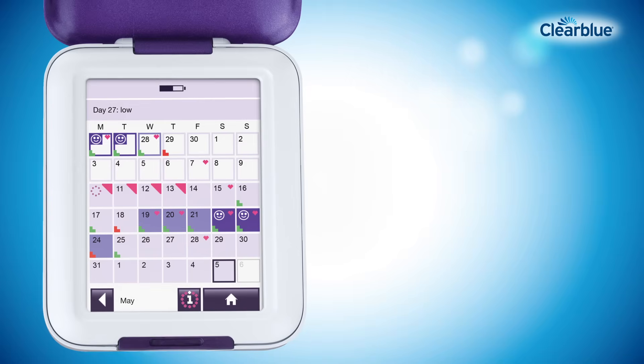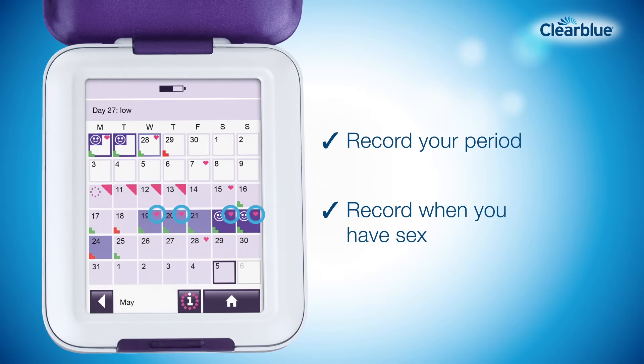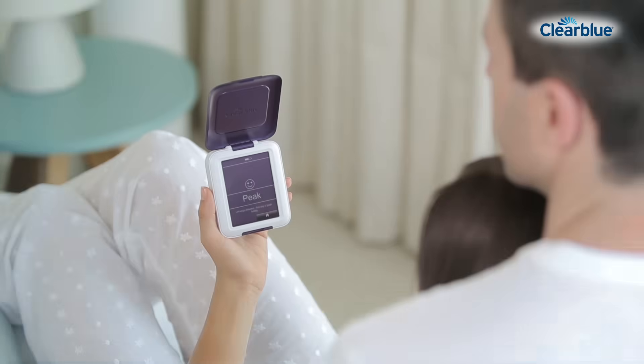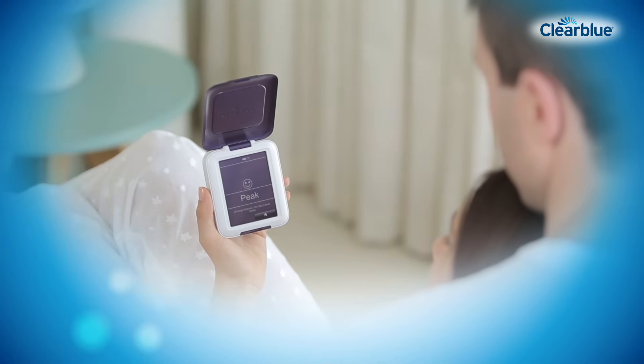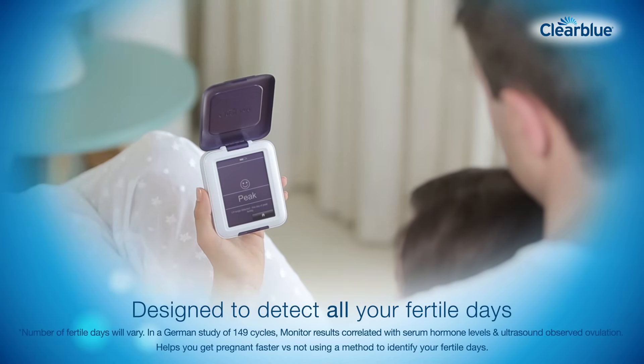On the calendar screen, you can also record the days you have your period and how heavy it is, and you can record when you have sex. This helps to confirm that you are having sex on the best days of your cycle to get pregnant. The cycle summary shows information on your previous six cycles on one screen. The Clearblue Fertility Monitor is designed to detect all your fertile days to help you get pregnant faster.